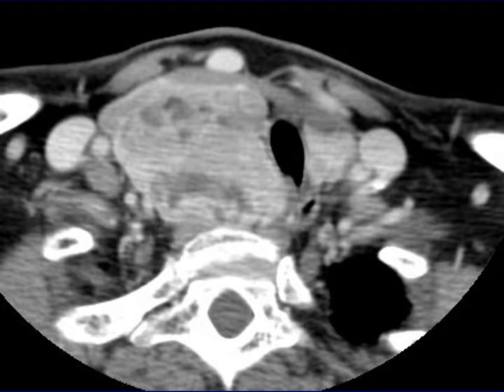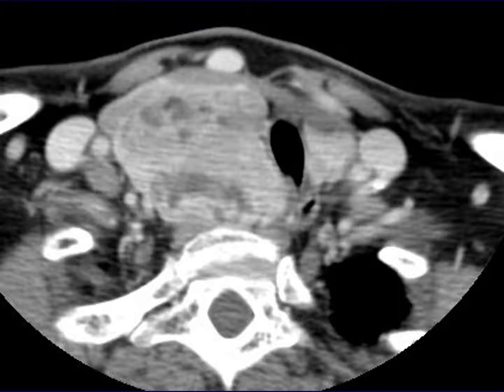Here's an example of a benign appearing goiter — it has none of the malignant features we talked about. When we encounter a thyroid mass like this, there are a few things that are really useful to the surgeon. Namely, we want to talk about the effect on the trachea: is it displaced off midline — mild, moderate, or severe — and is it compressed from its normal lateral dimension. Another important factor is whether the mass extends below the sternum, as it may be more difficult to extract surgically and may require assistance from a cardiothoracic surgeon.